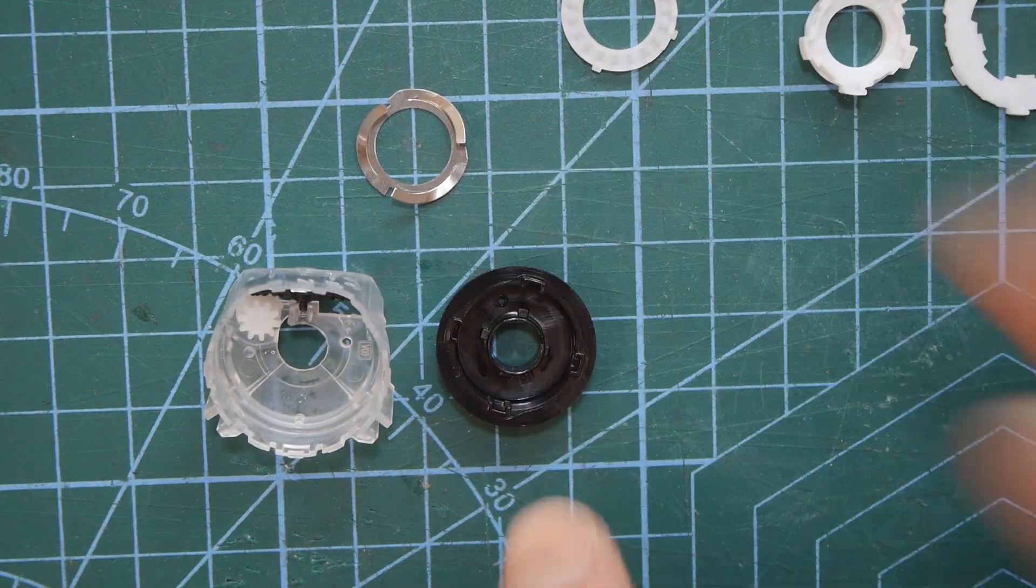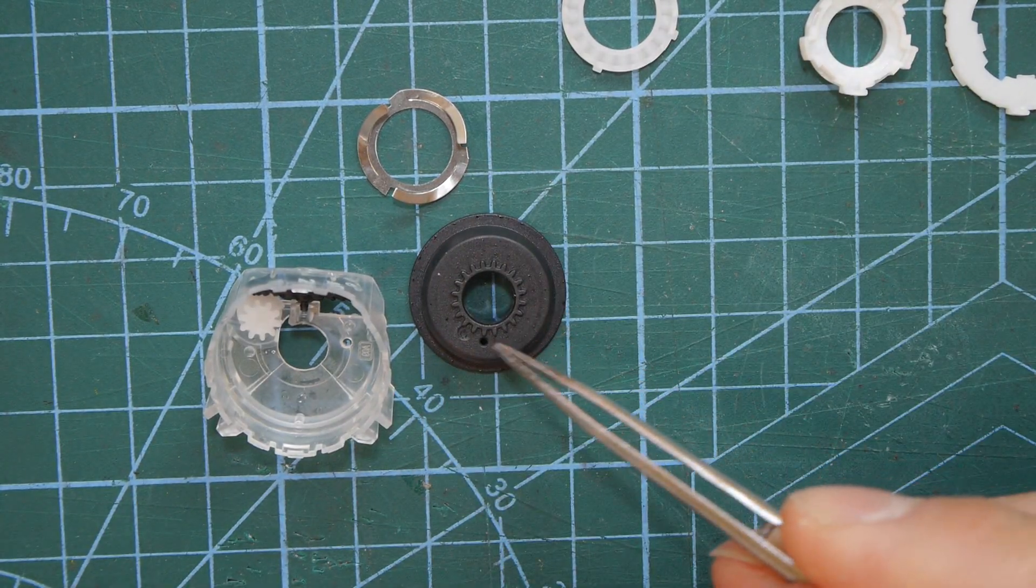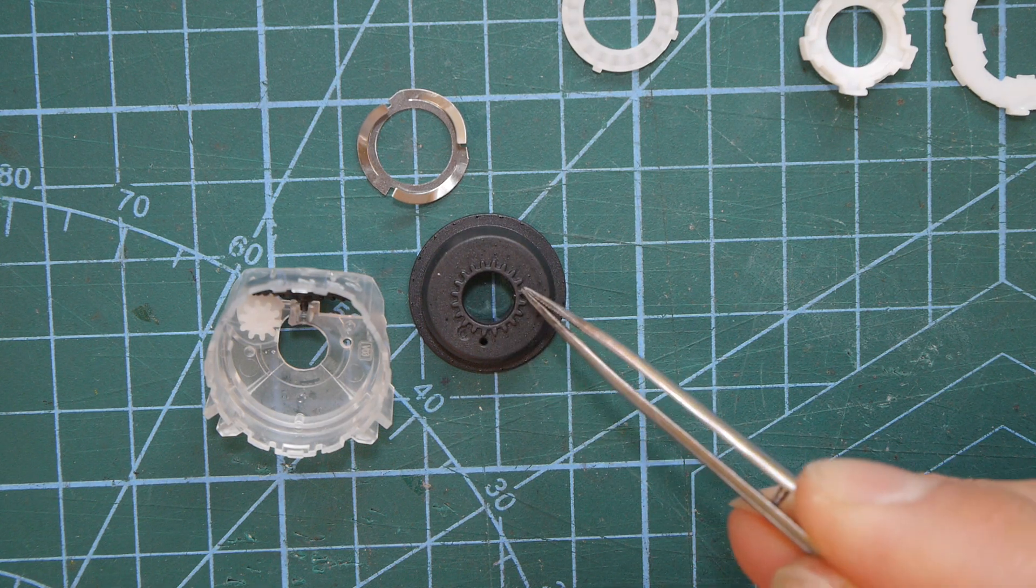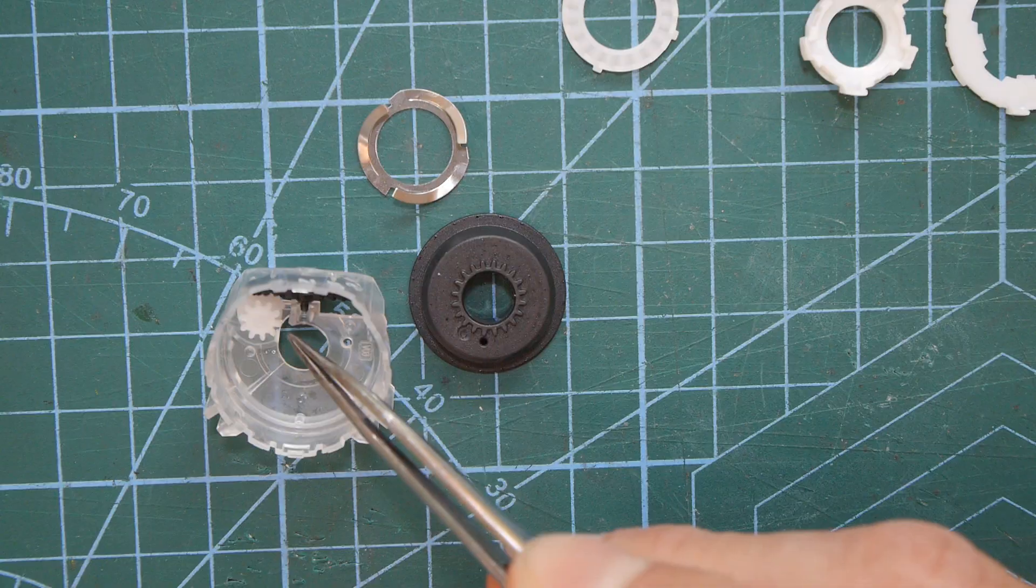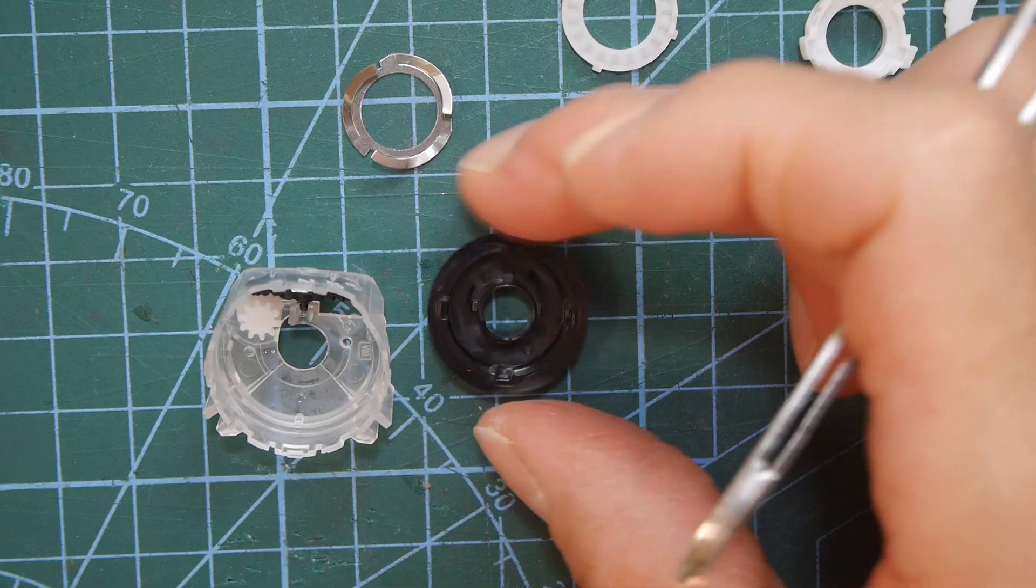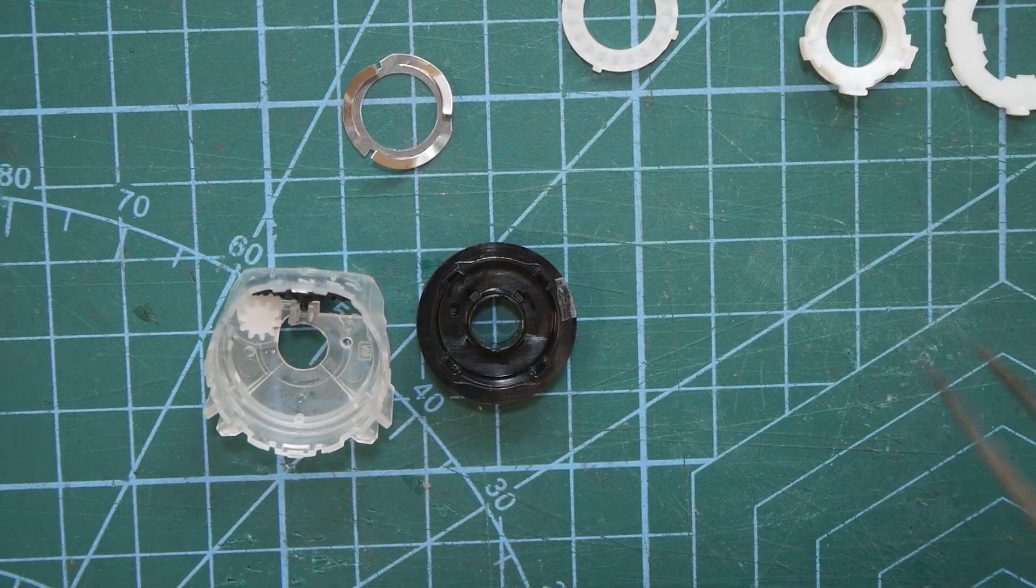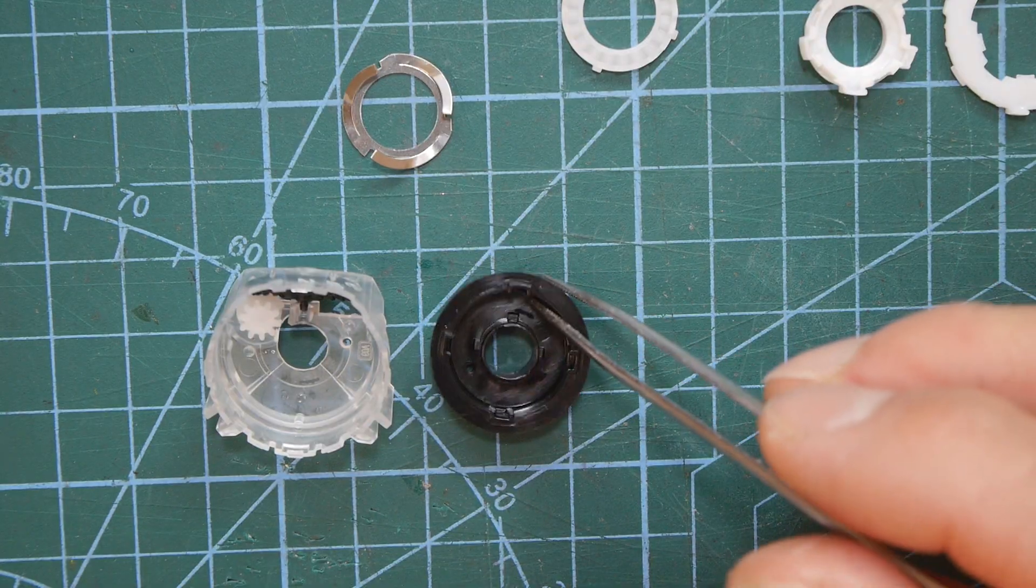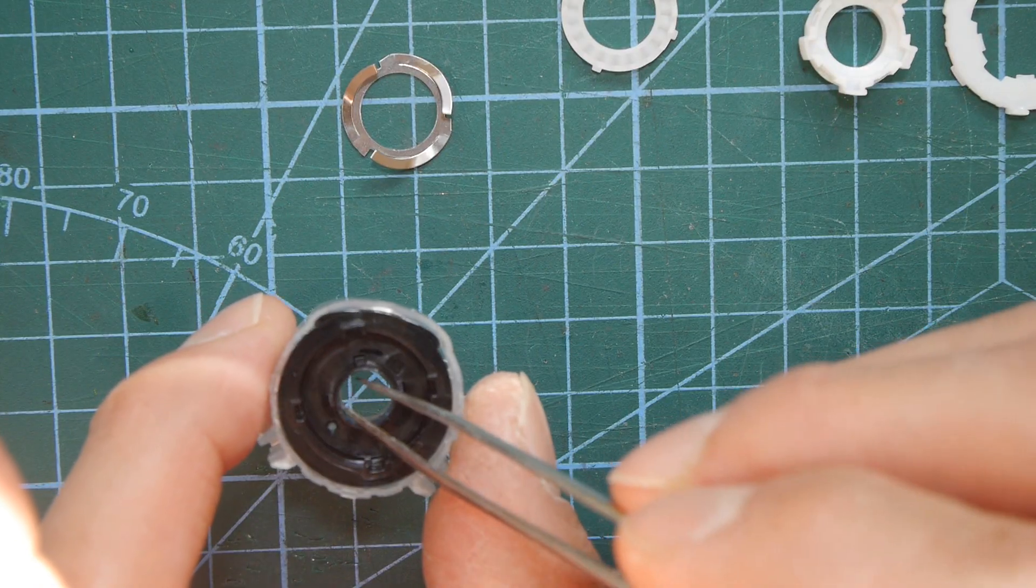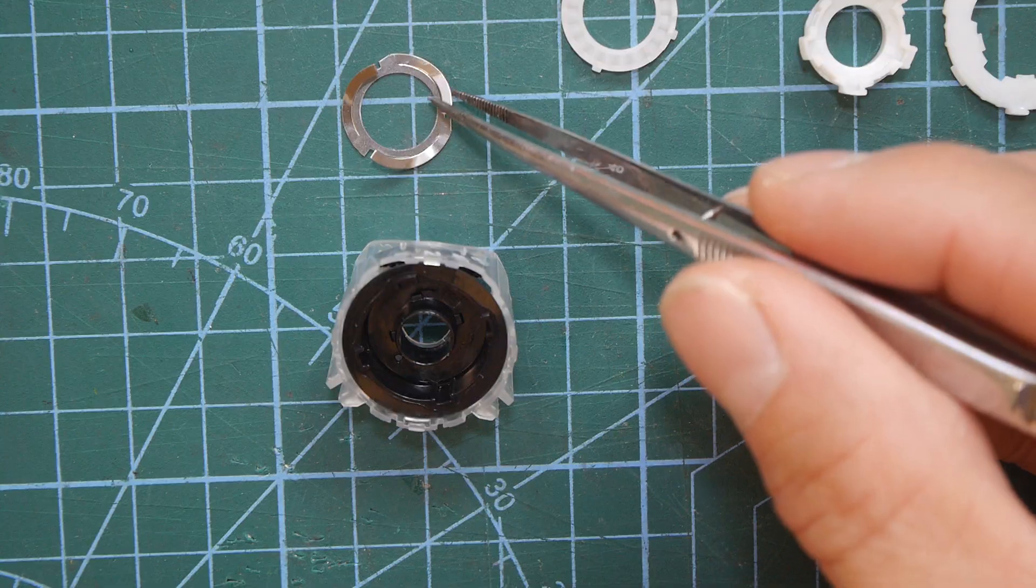If you remember the next piece that came out was this mounted that way but if I turn it over can you see gear teeth here. And those gear teeth mesh with this little one here on the top of the worm drive so every time we puff we've got to cause this black disc to rotate. So let's put that back in and we've got to make sure that it meshes with the gear below.